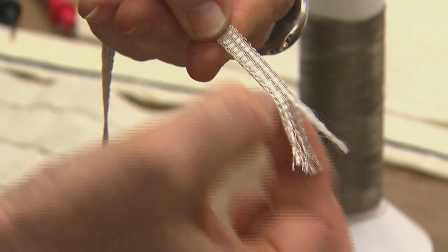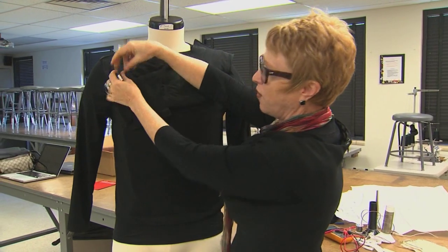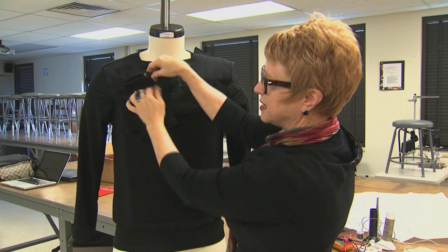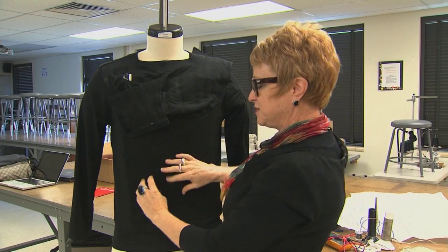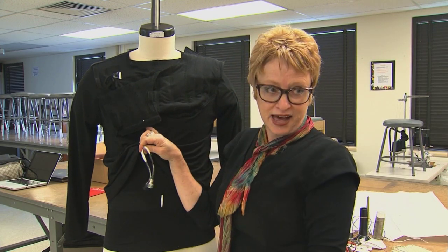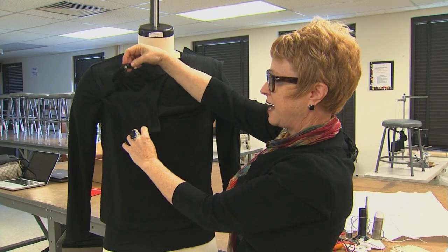Wires that transmit information from the electrodes are woven into a ribbon sewn into the shirt's top layer. And they all come up through a hole in the outer garment that are then soldered onto an attachment that goes into the central processing unit. And as we were going along, we realized that these ribbons, even though they have very good signals, when they touch each other, they short the signals out. So then we had to go back through and cover each one of the ribbons with fabric in order for it to have the proper ground.